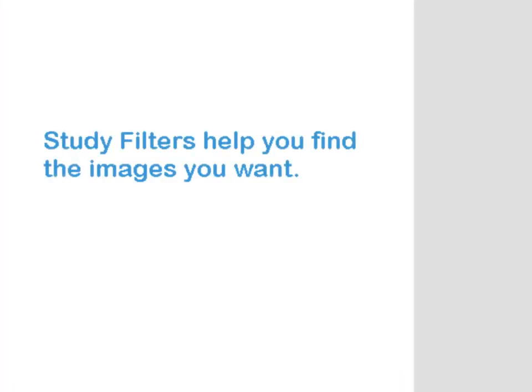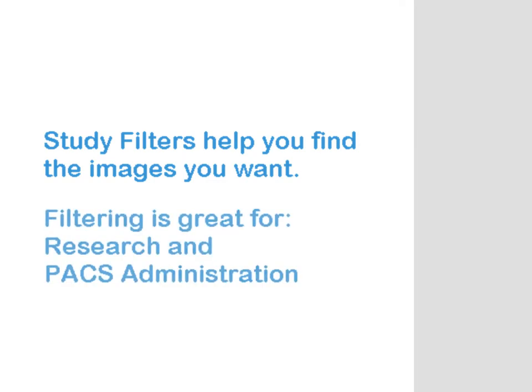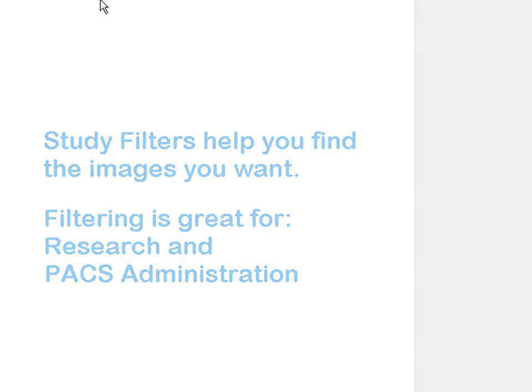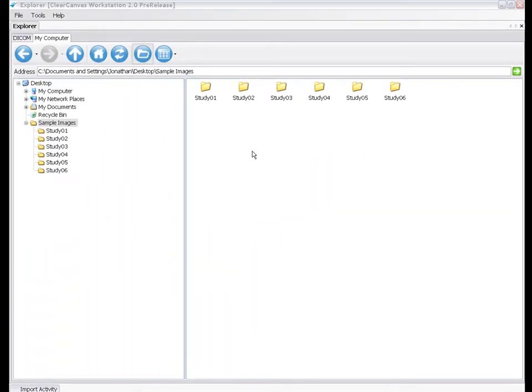Using Study Filters is an easy way to find just the images you want in a study, like in research scenarios where you want a subset of images from a study, or as a PACS Admin when you want to quickly track down problematic images.